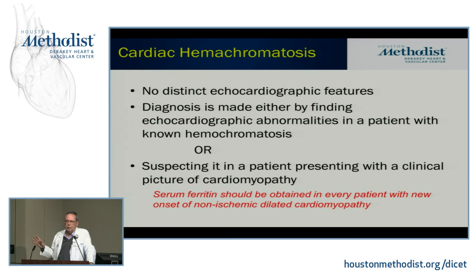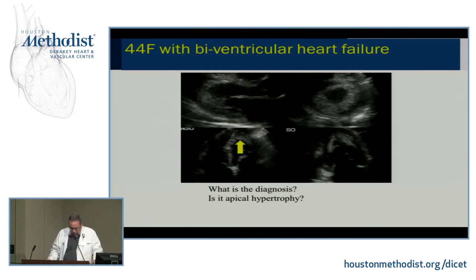So very simple test. Now, MRI will give us great information, but the truth of the matter is that a ferritin will give you a lot of information and with a much lower cost. I think, in my opinion, where MRI plays the biggest role is when somebody already has hemochromatosis. They look well, and you're trying to pick up early stages. And I think Dipan probably will talk more about that. But that's where I think the money is in the MRI, because at that point in time, the echo might not necessarily give you all the information.